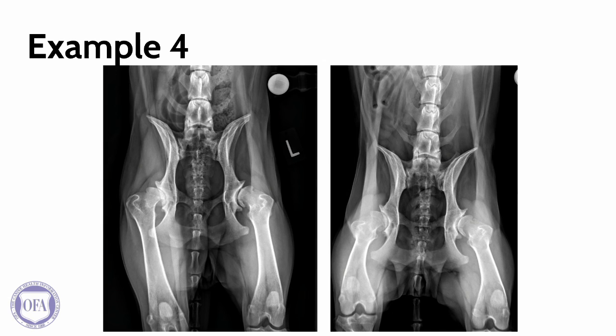On retake images seen on the right, the spinous processes are seen to the left of midline. However, the obturator foramen are more symmetric than on the previous study. The limbs are parallel to one another.